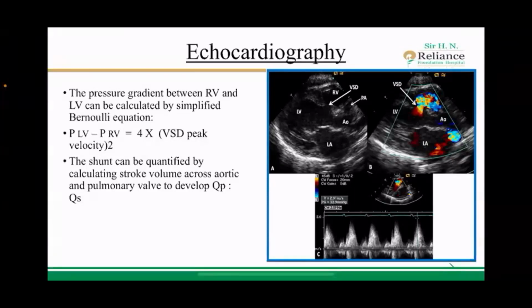But in case of a shunt, for example a left to right shunt, the blood flow across the pulmonary circulation will increase. So QP to QS will be more than 1. So by getting the gradient, you get to know the type of shunt, and by the values, you can assess whether or not it needs to be addressed.